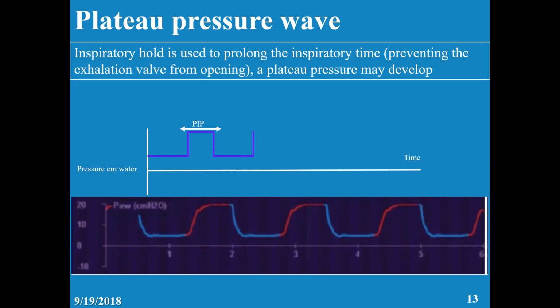Inspiratory hold is used to prolong the inspiratory time, preventing the exhalation valve from opening. A plateau pressure may develop. So you can see the pressure plateau. So this is a pressure control.